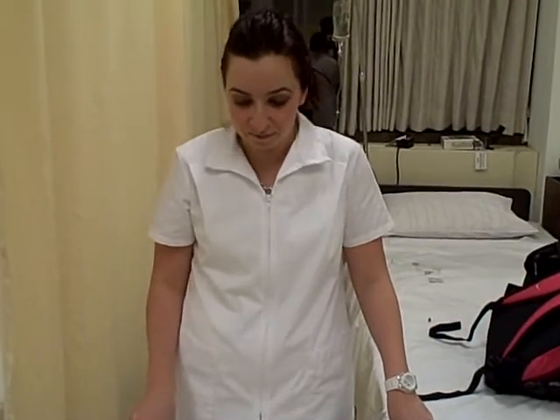First I'm going to do my seven steps. I'm going to identify the patient, identify myself, check the doctor's orders. I'm going to make sure I have the right equipment, wash my hands, tell the patient what I'm going to be doing, and provide for privacy.